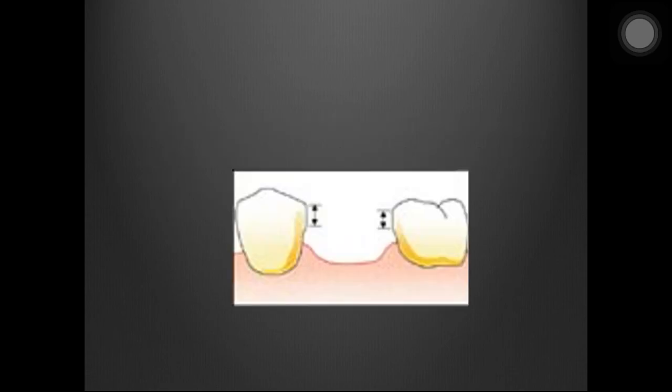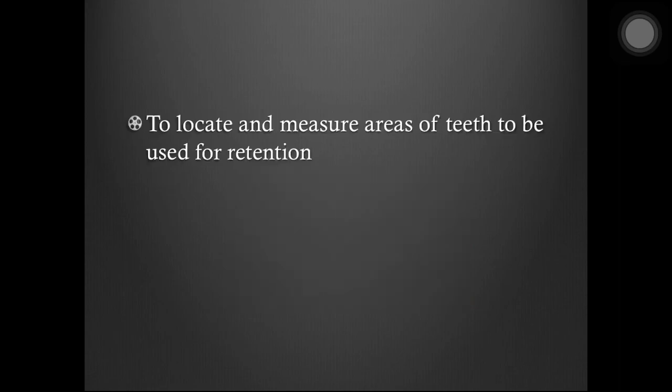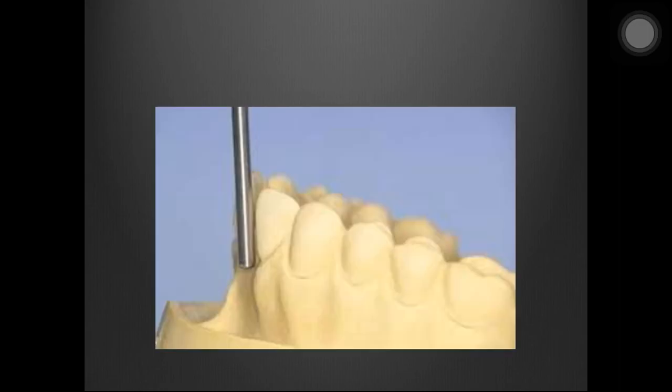So here we made these two walls parallel to the path of placement. Also, another purpose is to locate and measure areas of teeth to be used for retention. Now this is the point.